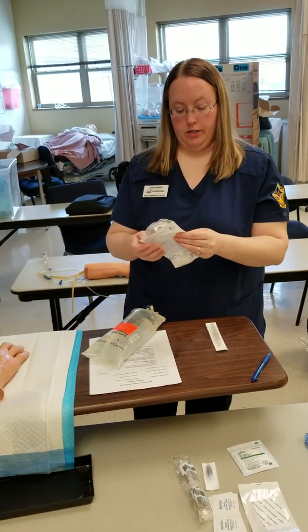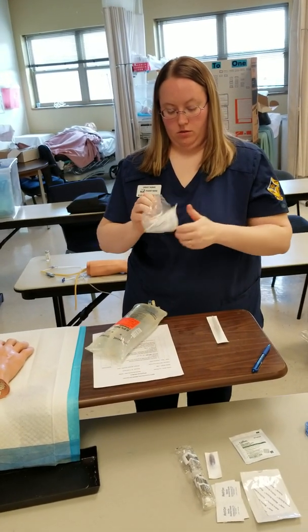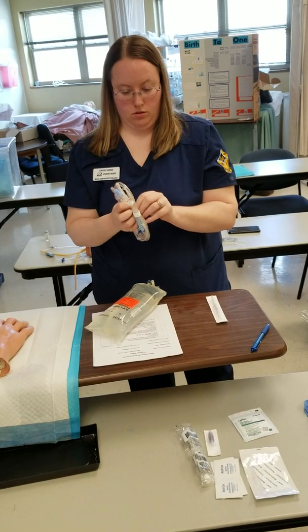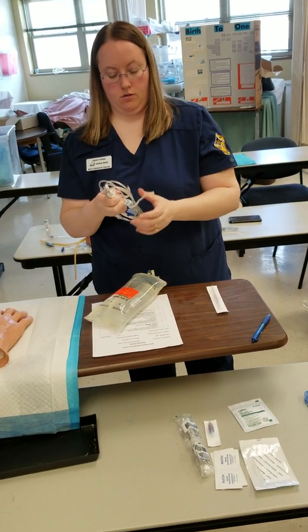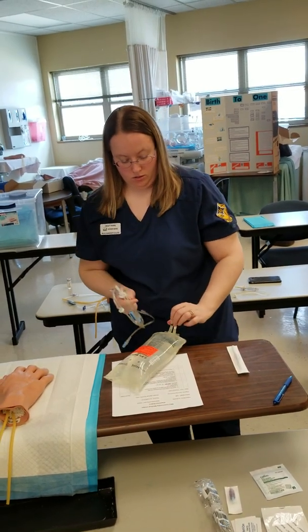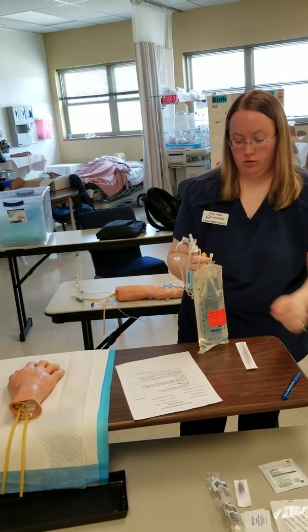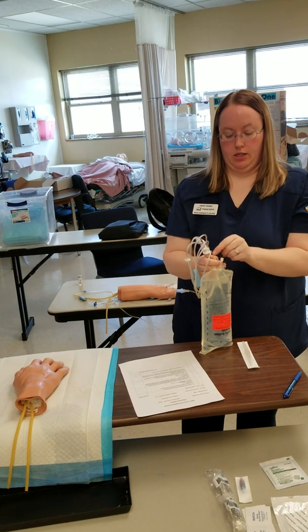And I'm going to open my package of tubing. I'm going to spike the bag, making sure to keep the ends sterile, both the IV and the spike.